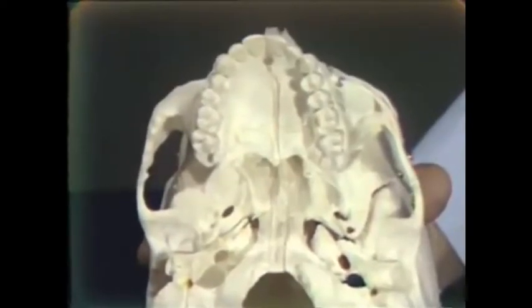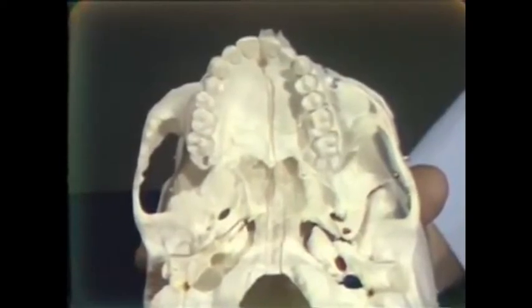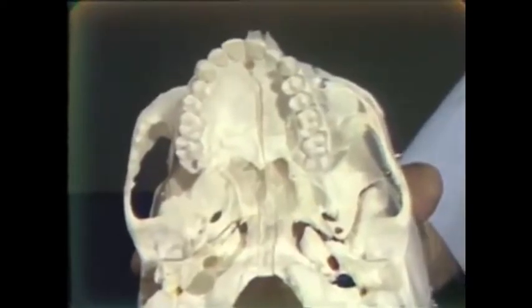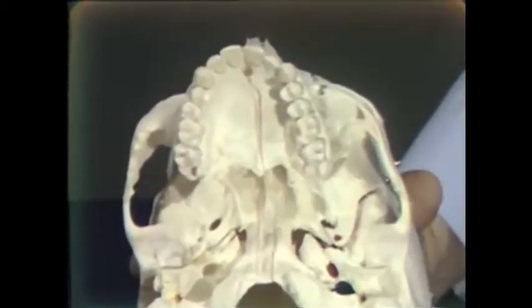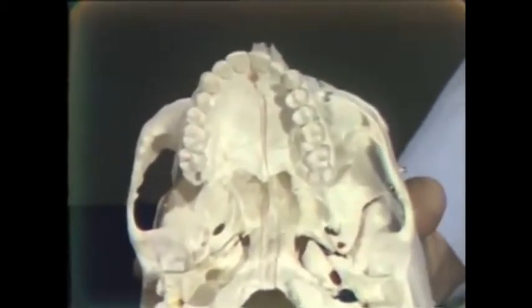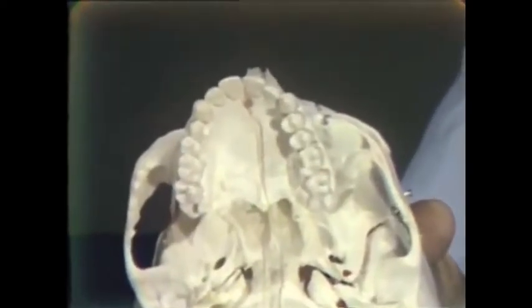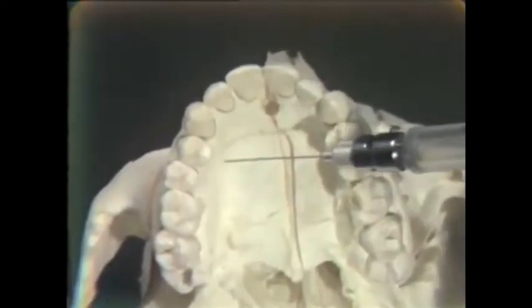If it is not necessary to block the entire anterior palatine nerve, we can infiltrate just palatally to the tooth in question and so-called get a partial anterior palatine block. Let us suppose we were going to remove this maxillary first bicuspid. It wouldn't be necessary to give the anterior palatine block, but just simple infiltration about a centimeter from the gingival margin on the palatal side of that first bicuspid in such a fashion as this.